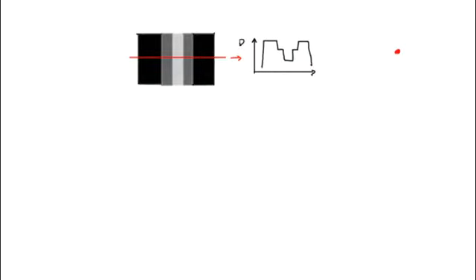So go back to this picture. We want to deliver this particular fluence profile. Let me draw a source here and a beam coming out. And here you put the compensator up near the head of the machine. And the thickness in the center will be very thick. That delivers the low dose in the center. And thinner on the edge here, and then thinnest on the outer edge. Okay, this whole thing is filled with metal. So typically it's brass or maybe tungsten, and that delivers the attenuated dose that you want.